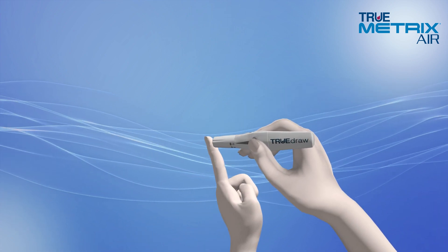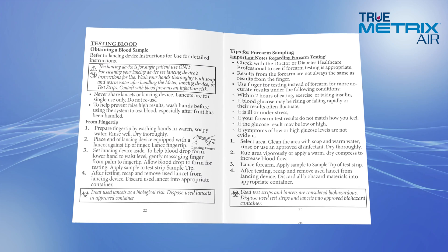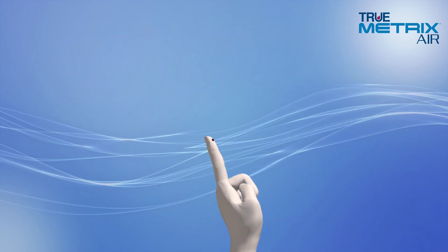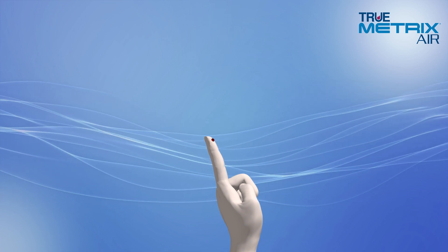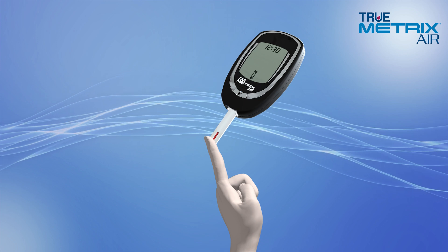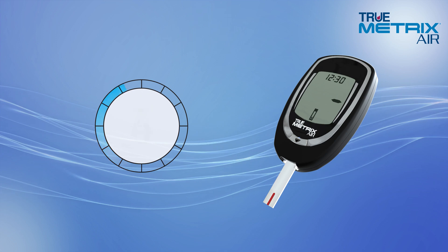Next, using your lancing device, obtain a drop of blood from your fingertip. If you prefer to use an alternate site, refer to the owner's booklet to learn about this type of testing. Make sure to allow a small blood drop to form, then touch the test strip sample tip to the blood drop and hold it there until the meter beeps. Dashes will appear across the display to indicate that the meter is testing.